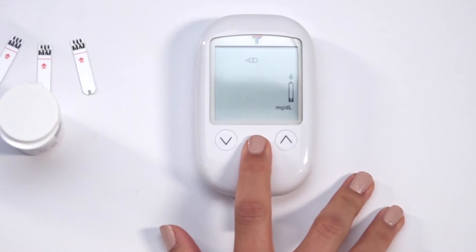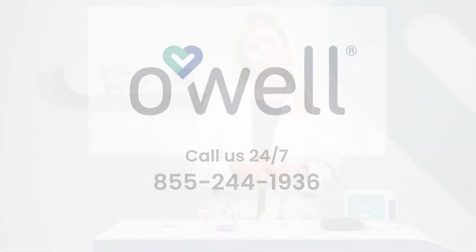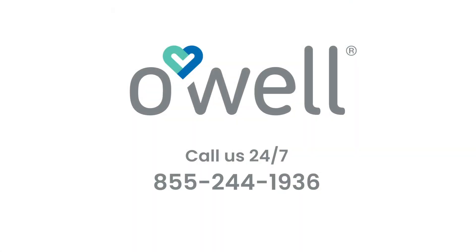Press M again for 2 seconds to switch the meter back to normal testing mode. You can always phone our 24/7 call center for professional support. Thanks so much for watching and we hope this helps.